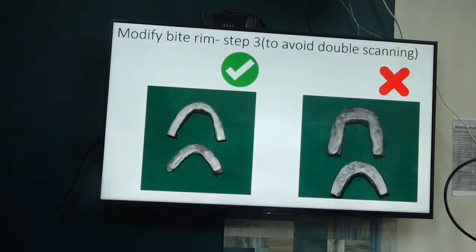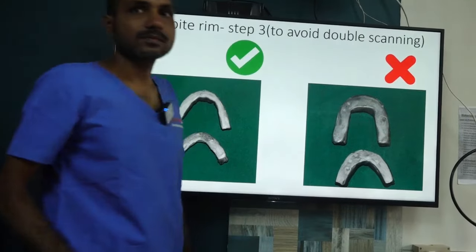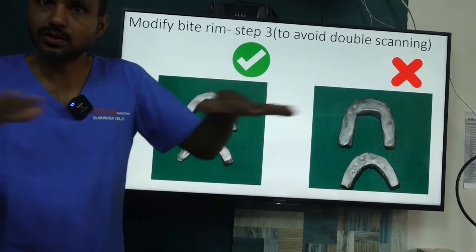Next one. So, another modification, totally three modifications. See, here it is very thick. So, you have to do this, no? Buccal lingual scanning. If it is too thick, it won't scan because it is too wide.